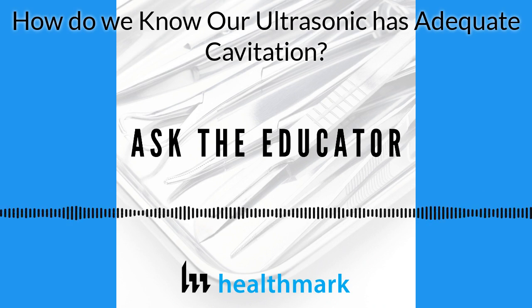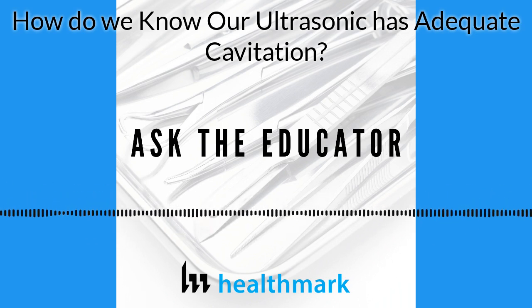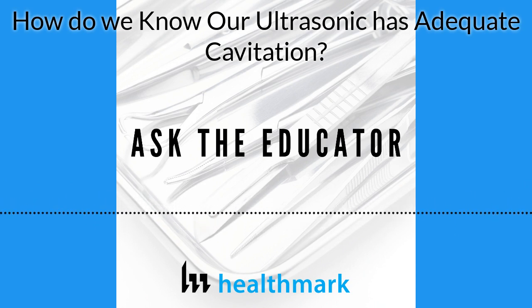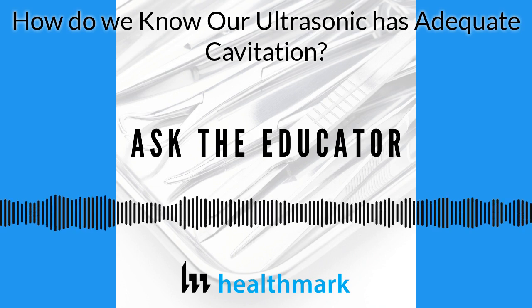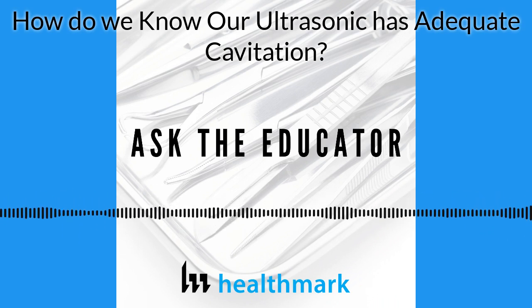And there are many factors that affect cavitation, from the type of cleaning solution you use, because cleaning solution lowers surface tension. And when you lower surface tension, you can increase your ability to create the cavitation in the bubbles. So that's why you use a certain detergent. Temperature and all that comes into play. So you want to make sure that you are specifically testing for cavitation by itself.